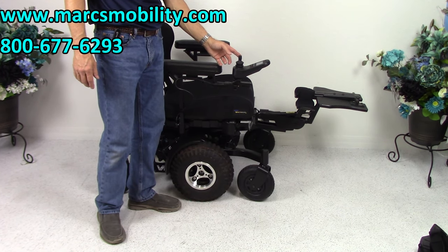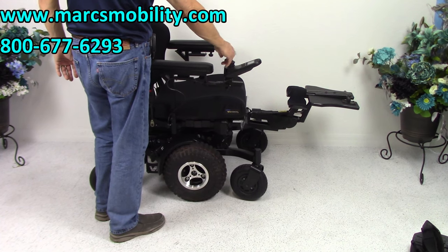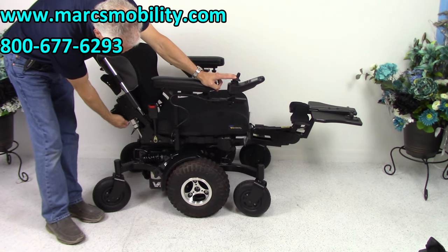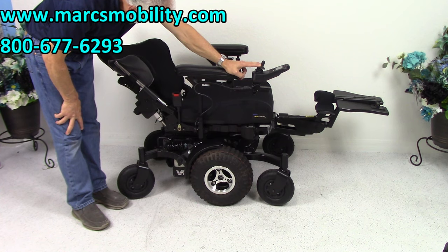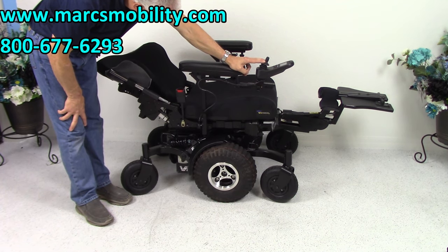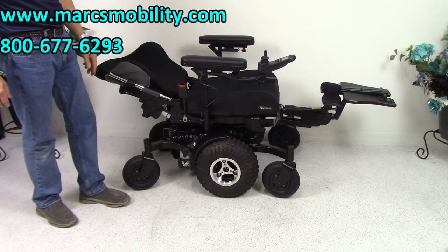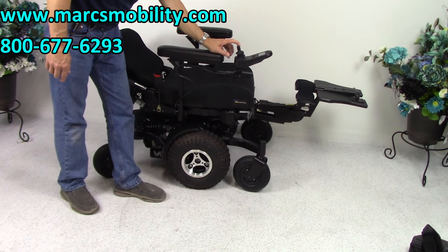The last function is called the electric recline — that's just the back of the seat. You push the joystick forward for the recline to go back. There are two motors, one on each side for the recline. This chair is so well-built. We'll see how far it goes — everything in this chair is built very, very solid. So if you were laying flat in your chair, the recline goes all the way.